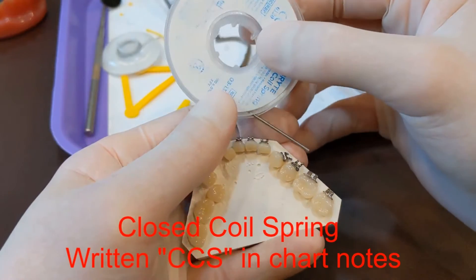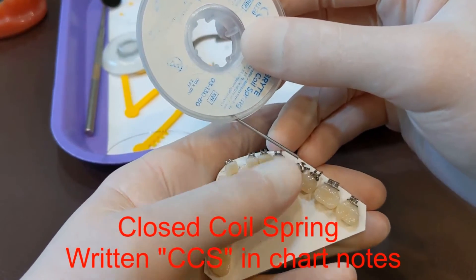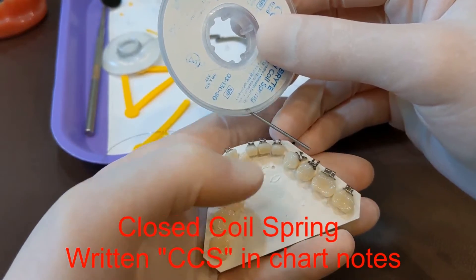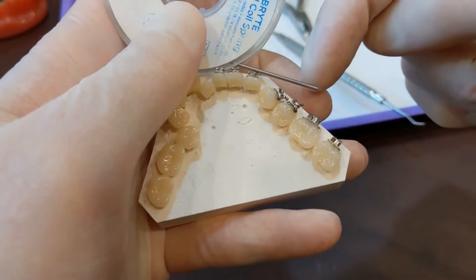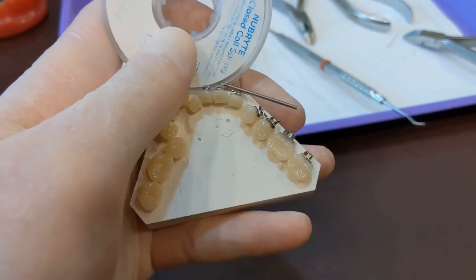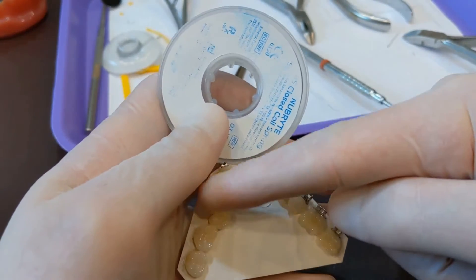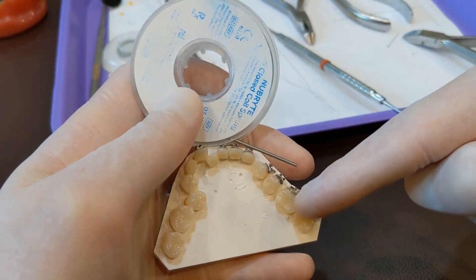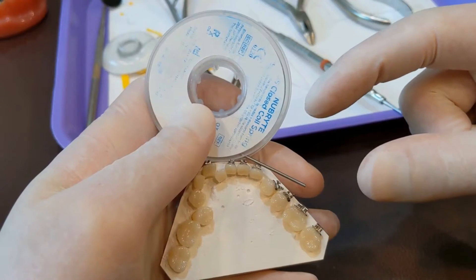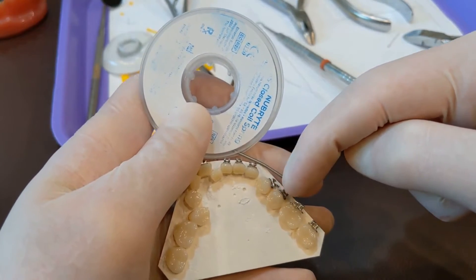Now I'm going to show you how to do a closed coil spring. With open coil spring, the little coils in the spring are open, so it's meant for pushing. Closed coil spring — as you can see the coils are all touching — so it's just meant for holding space. You would put this in if you had a space where you wanted a chain on the wire but there was a space you didn't want to close.